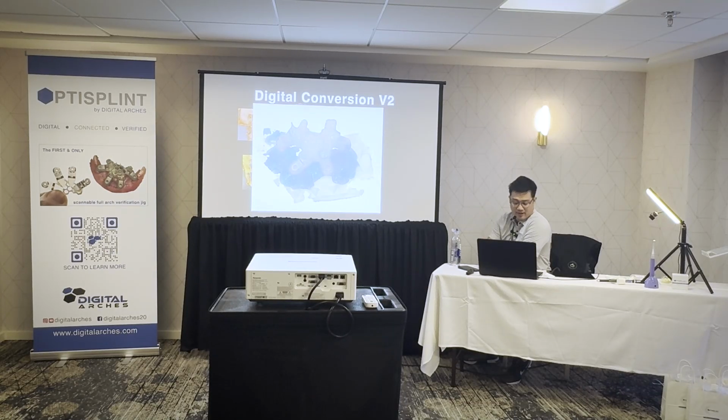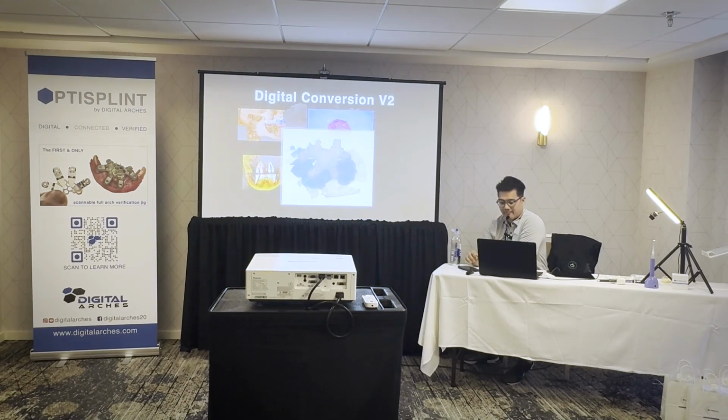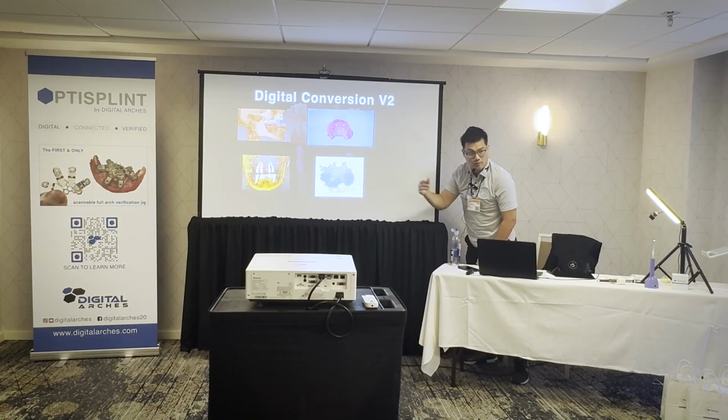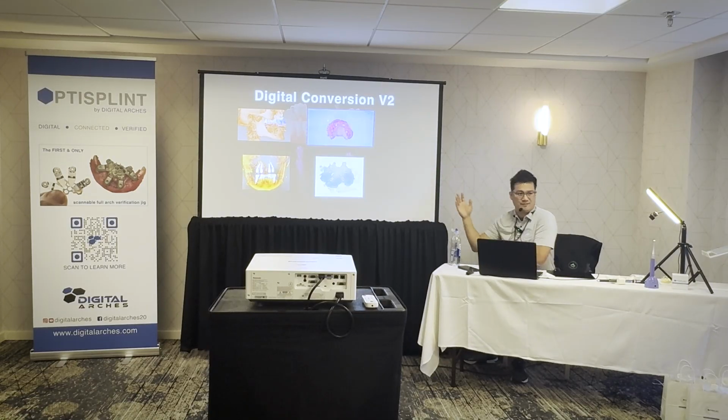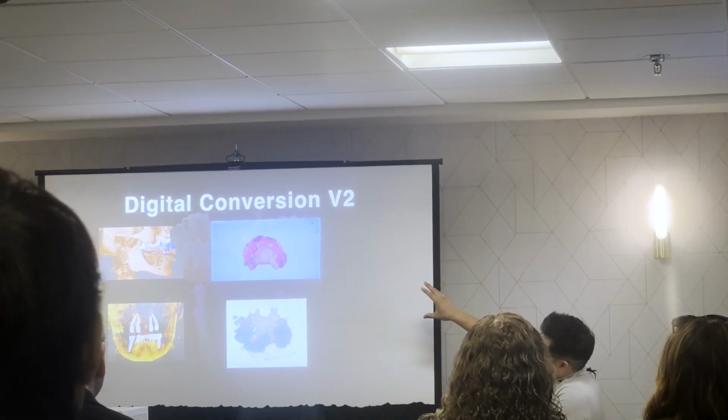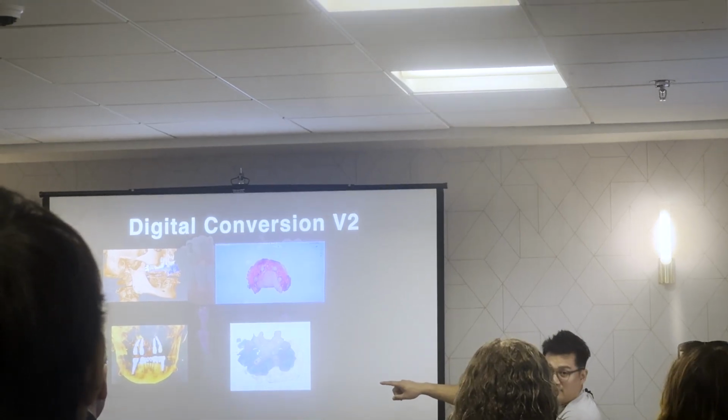I don't need the scanner in the mouth. It's much more accurate and easier to do it outside the mouth. If it's a case that I'm doing locally, I will scan this on my lab scanner, right? Because this has to be scanned with the flap open, but it doesn't have to be scanned. Because all I'm doing is taking my tissue scan, I'm merging those healing caps to my CT scan.